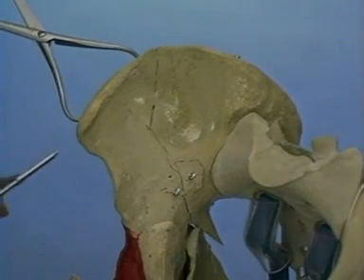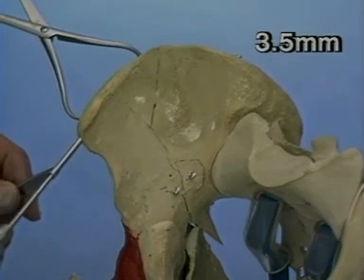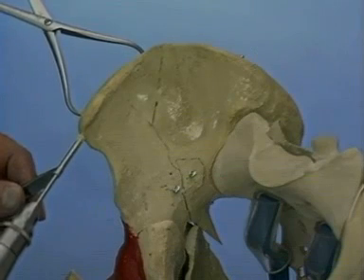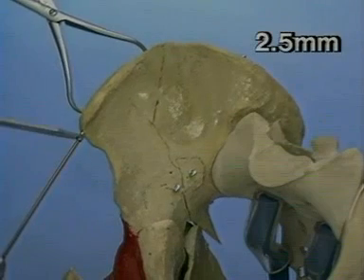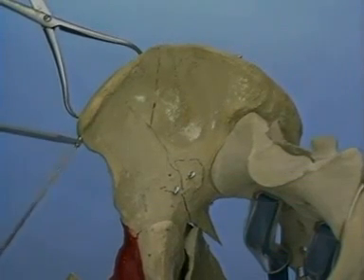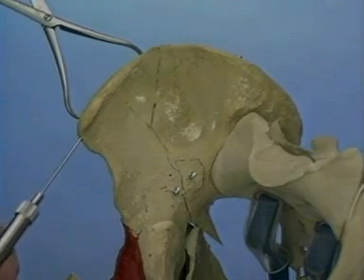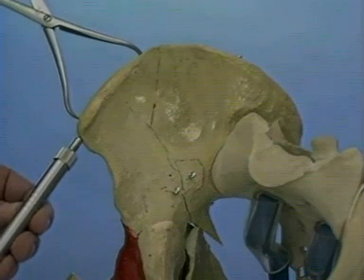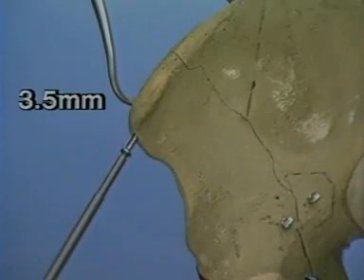Another 3.5 mm lag screw is inserted parallel to the iliac crest. The gliding hole is started at the anterior superior spine with the 3.5 mm drill bit. The 2.5 mm drill bit completes the hole. The depth is measured and the screw is inserted.